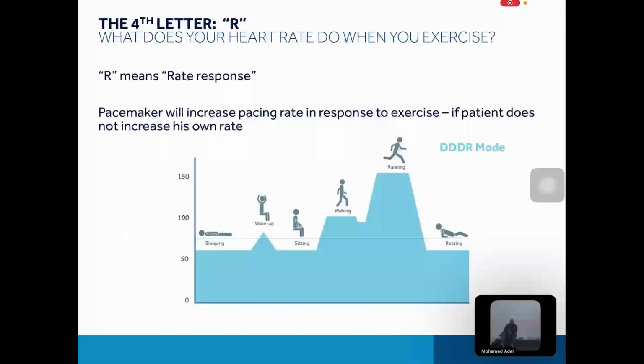The fourth letter is R. What does the heart rate do when you exercise? R means rate response, and all of you understand the rate response. But can anyone imagine how the pacemaker knows that this patient will exercise?